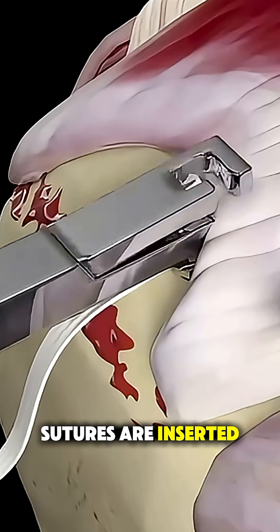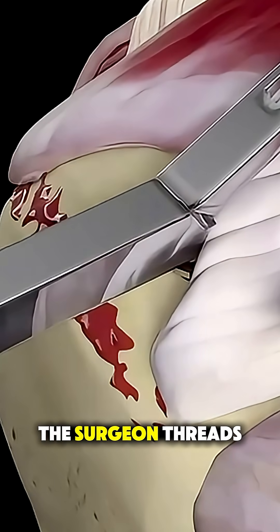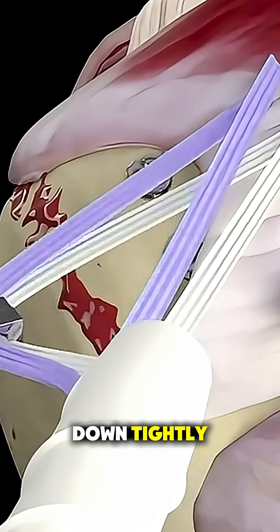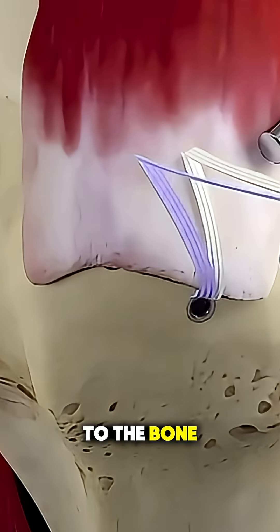Anchors with strong sutures are inserted into these holes. The surgeon threads these sutures through the torn tendon and ties them down tightly, reattaching the tendon to the bone in its proper position.